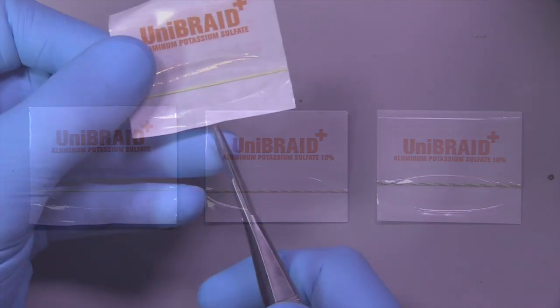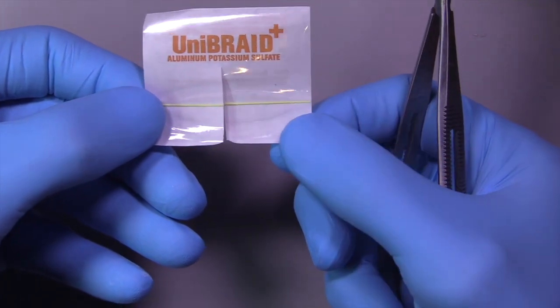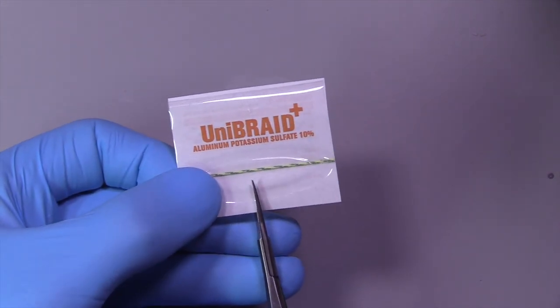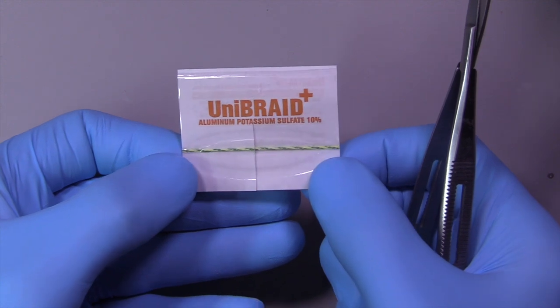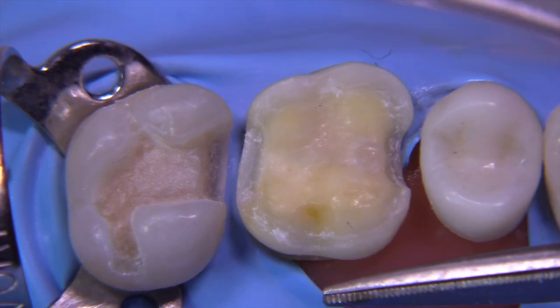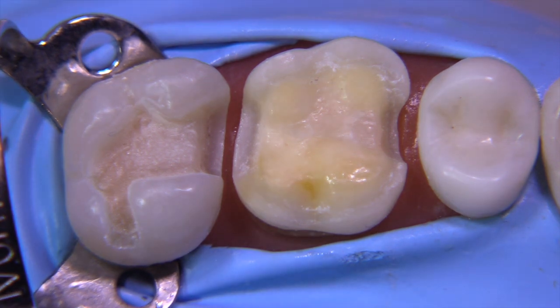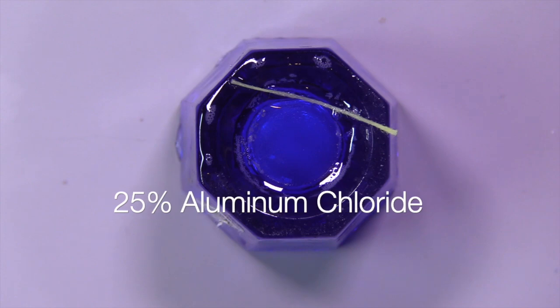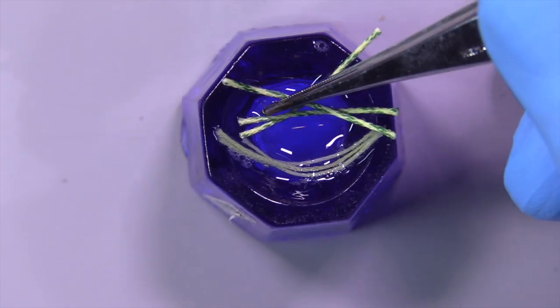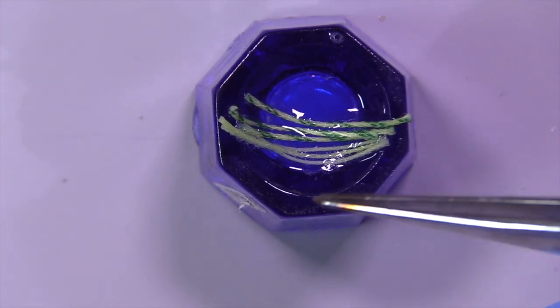Please note that these are braided cords, not knitted cords. If we're going to be using these for an inlay or onlay, I like to cut them in half so they're not quite as long and we can use them in the interproximal area. We're going to prepare the cords for this particular case — I'm going to use a zero cord followed by a size two. We'll cut the septal areas of the rubber dam, making sure the Castroviejo scissors tips are visible before we push so we don't inadvertently hit some tissue. Then fold the rubber dam out of the way, take your cord, and soak it in the hemostatic agent. I like a 25% solution of aluminum chloride, which you can purchase from a company or have made by a compounding pharmacy. Soak all the pieces of cord and then squeeze them just slightly dry before placing.